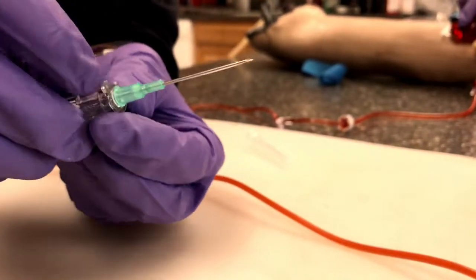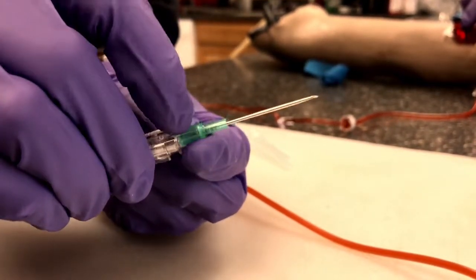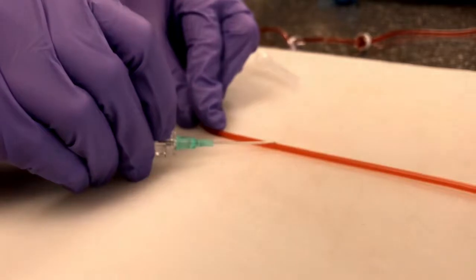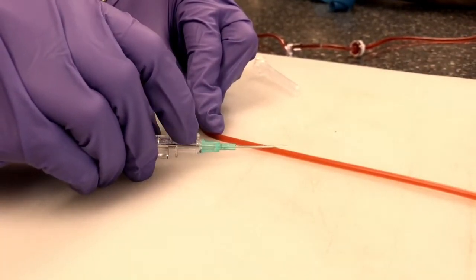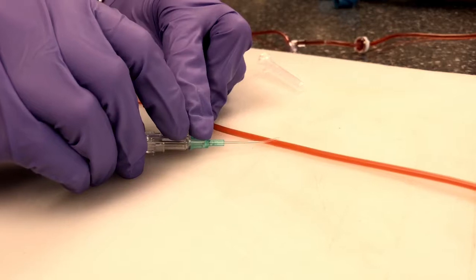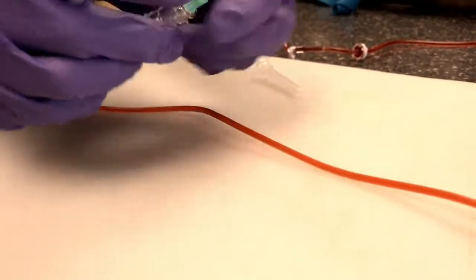The next thing is a dexterity issue. What you'll see very commonly is people pulling the needle back instead of pushing the catheter forward. So you can see here, watch where the tip of my needle is. What we want to do is keep the tip of the needle right where it is inside of the vein. Catheter moves forward. But what we see sometimes is people pulling the needle back, like so. Then you end up with just the tip of the catheter in the vein, and you have to try to float it in, and that's no fun for anybody. So you can sort of see what we're talking about here.